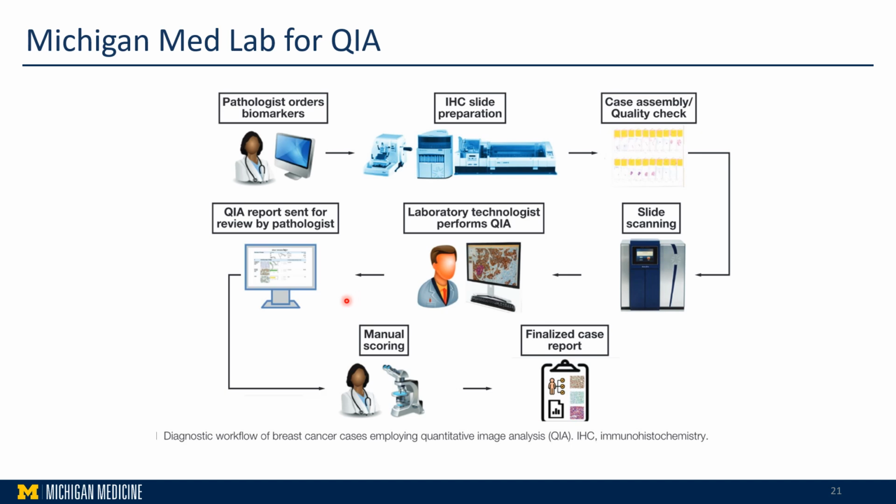The pathologist then reviews the findings and manually ensures that they agree with them, and subsequently reports the results of the quantitative image analysis. Ultimately, our final report is prepared and sent to both the patient and the treating provider.